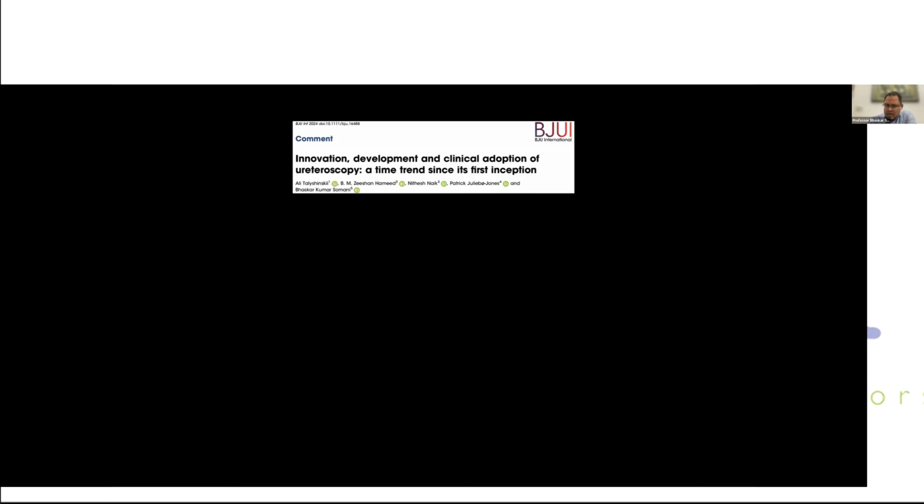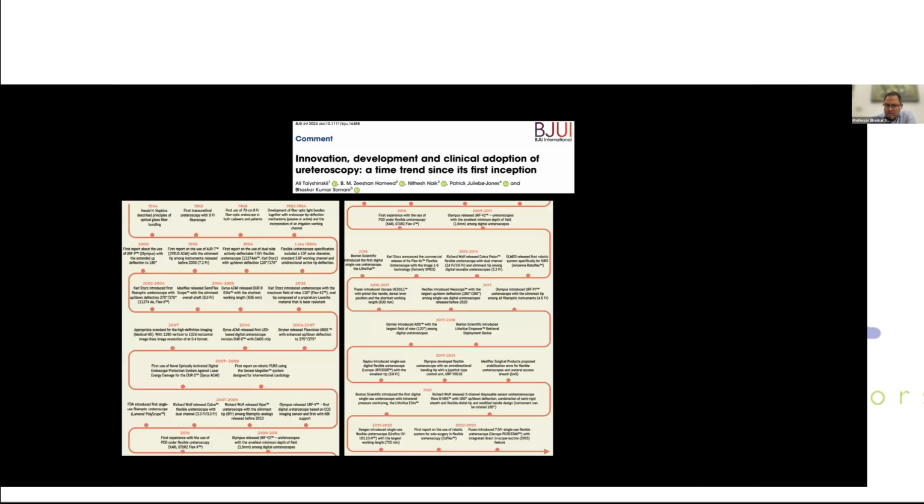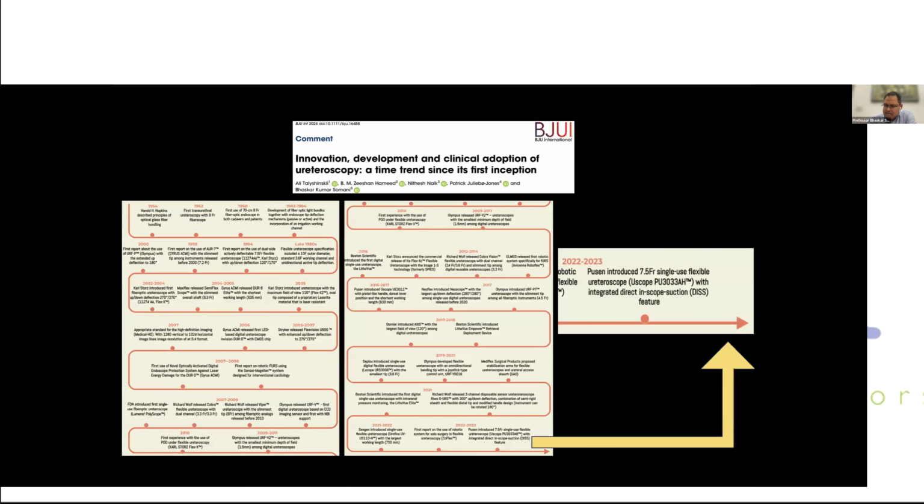So let's look at the innovation, development, and clinical adoption of ureteroscopy as a time trend. So right from 1954, there have been lots of innovations, and you can see different time points through the decades, through the years. The last innovation actually is the suction scope, that was the Pusen 7.5. So if we talk about the long list of innovations of flexible ureteroscopy, the suction is the last innovation that has been added to it.